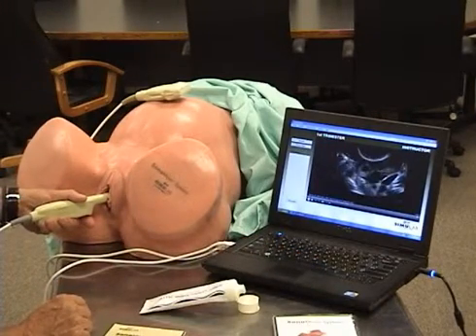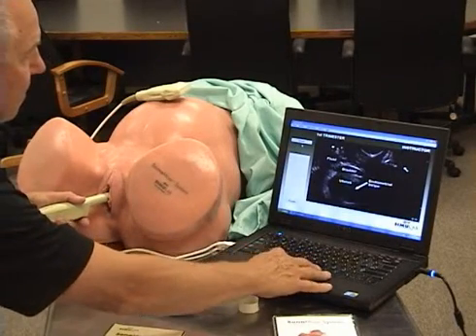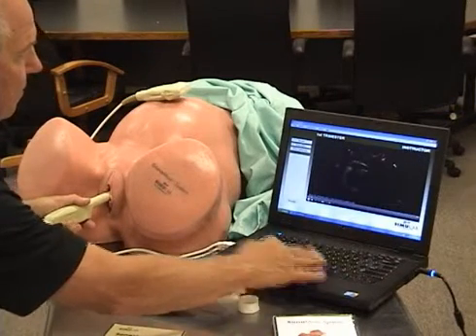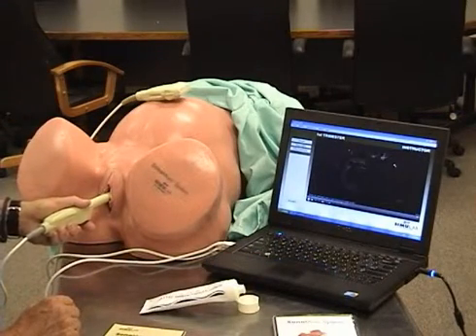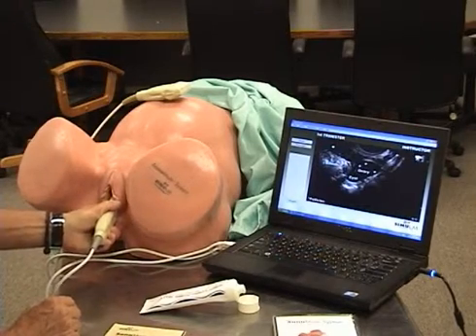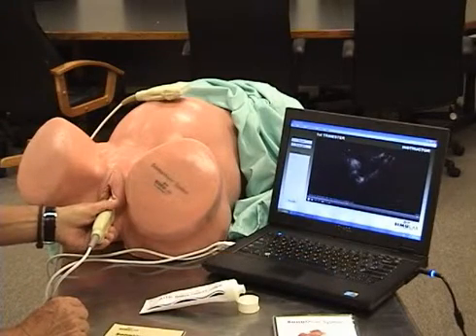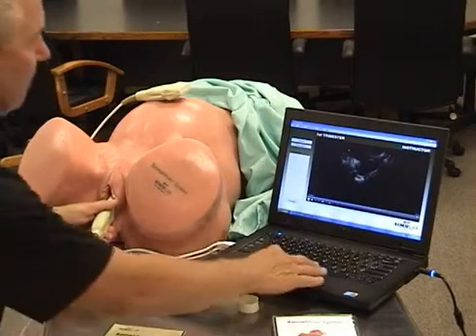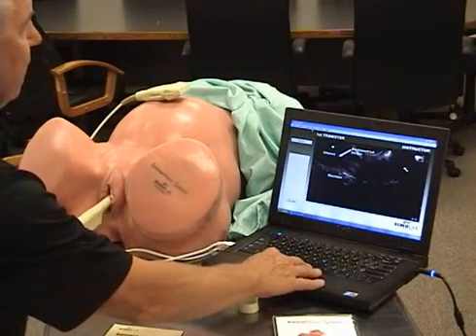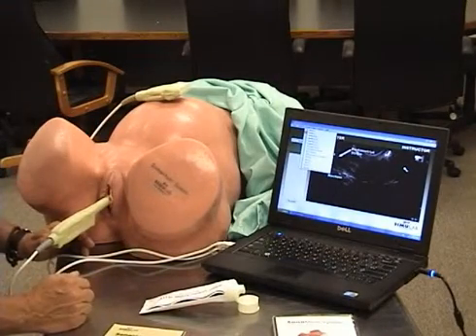As you'll notice here, in one location, two locations, and actually the third location. So this shows just one of the abnormals I've got here at ectopic 2.